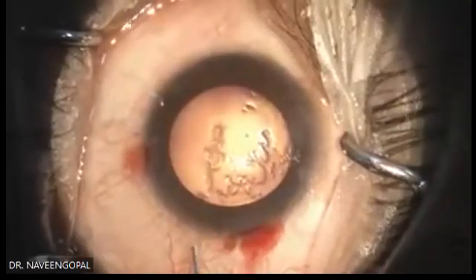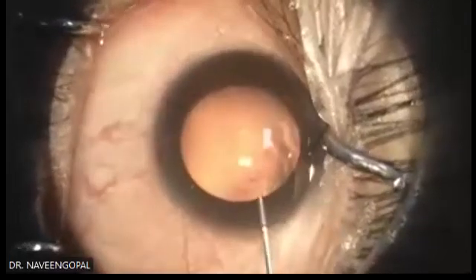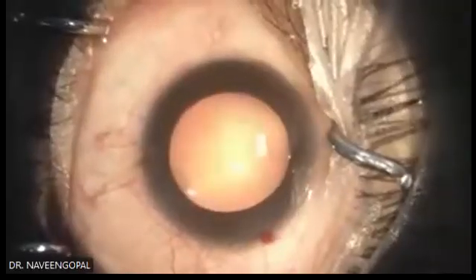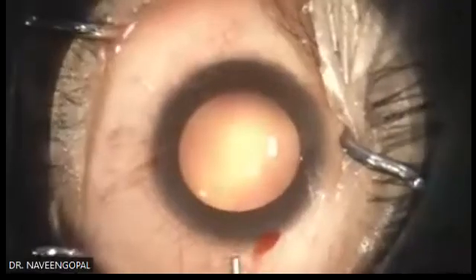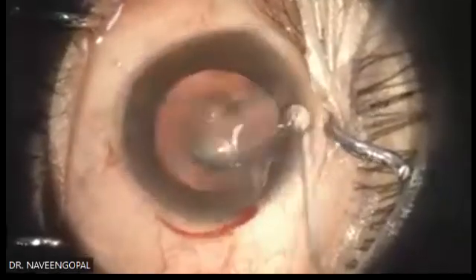I do all the 3 ports together. Please don't do it. Since I'm experienced, I'm doing it. Do each port. First do the main port, put the visco, and do the other ports later after putting the visco. Put your visco over the cornea so that it will be hydrated. It will not get dry.